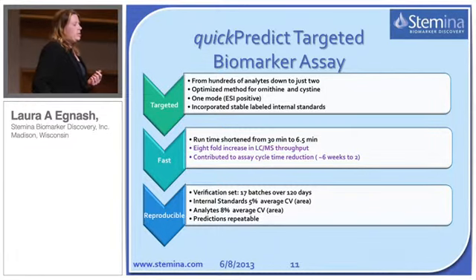And then once the assay was developed, we were able to show that it was highly reproducible by running a verification set of compounds. 17 batches over 120 days. Our internal standards and our analytes were well within the specs that we had set, and our predictions of teratogenicity were reproducible.